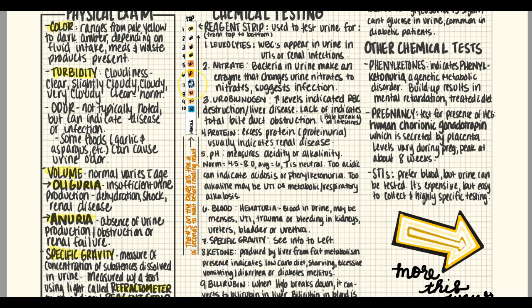The specific gravity is at 45 seconds. And then from there all the way up to the leukocytes. So blood, pH, protein, urobilinogen, and nitrate are all 60 seconds, so all of these guys here are 60 seconds after it's been dipped, and then the leukocytes are 120 seconds.